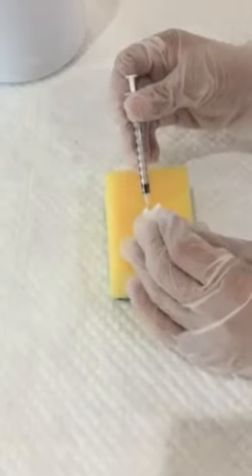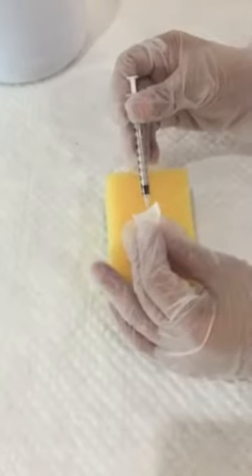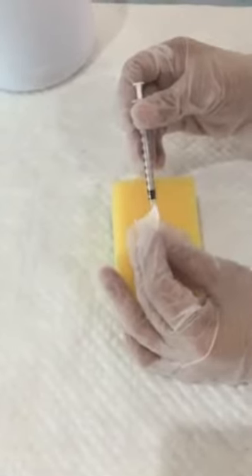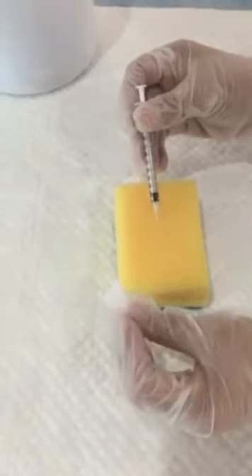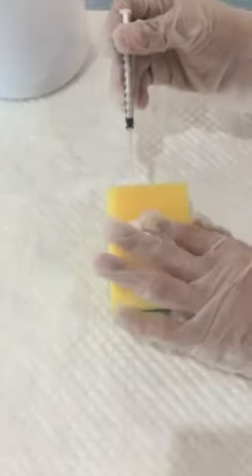If the client is thin or lean and lacks adipose tissue, the subcutaneous injection should be given with the skin pinched at a 45 to 60-degree angle. One way to check that the pinch of skin is subcutaneous tissue is to ask the client to flex and extend the elbow. If any muscle is being held in the pinch, you will feel it contract and relax. If so, release the pinch and try again.